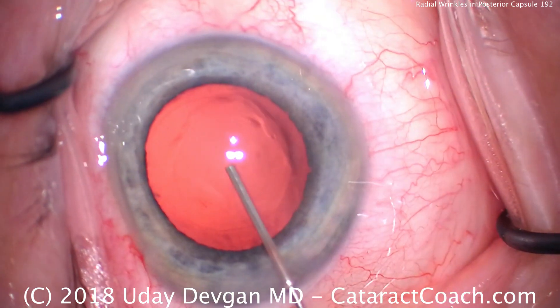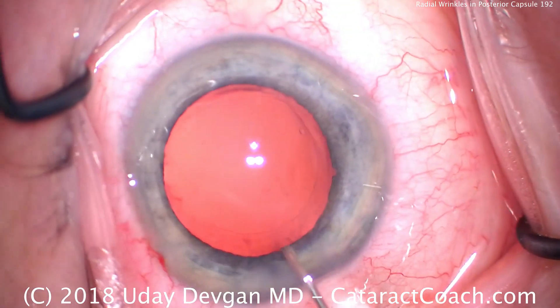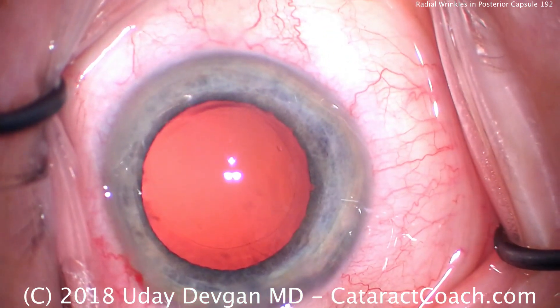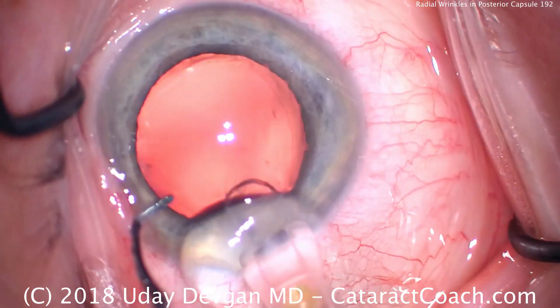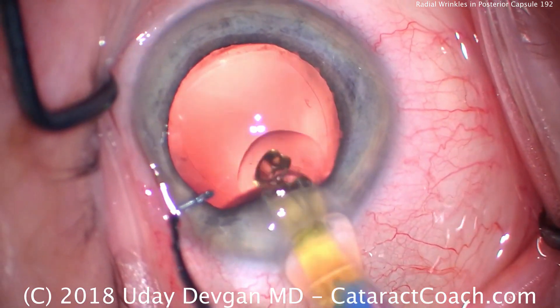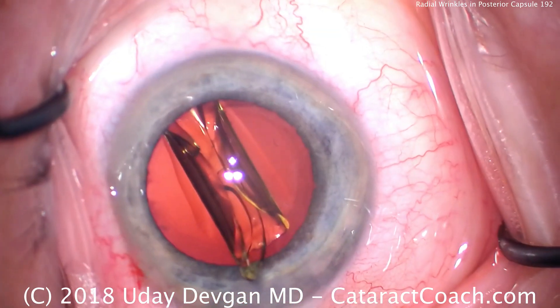That looks great. We're going to continue the rest of the case as usual. Everything else here is pretty routine. I just wanted to show you what it looks like when you inadvertently grab that posterior capsule. When you grab it, the key is to let go immediately. You can come off the pedal, going to position one, and that will release the vacuum.